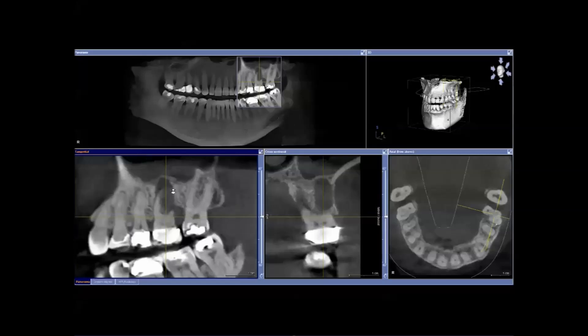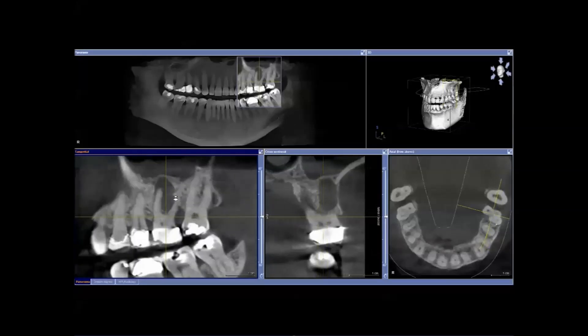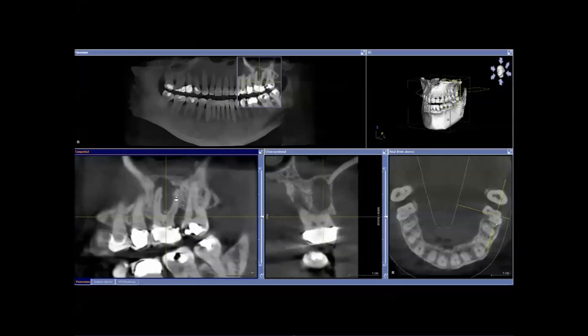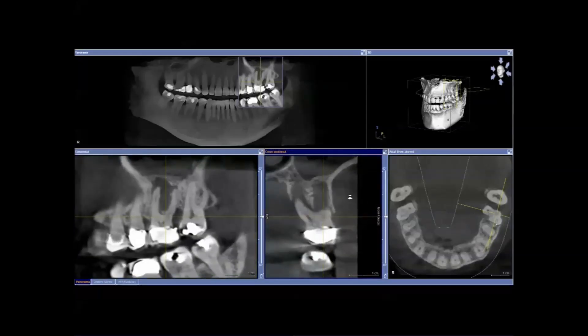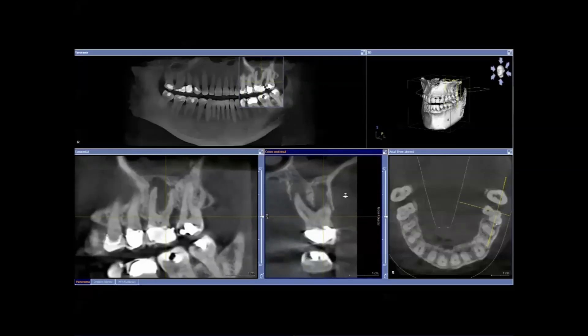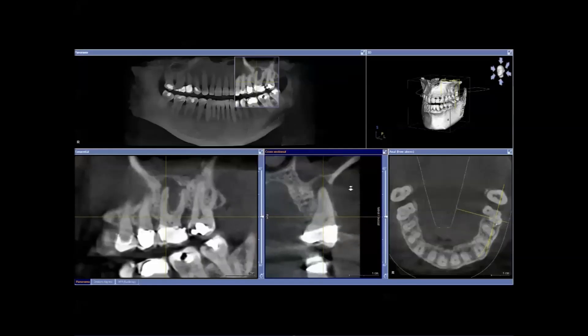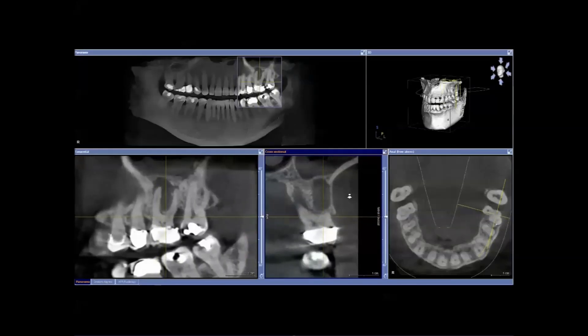This is how the patient initially presented — he had an upper left first molar with long-standing pain to biting, and the CBCT scan revealed extensive pathology around the tooth. All indications from probing and everything else were that the tooth was cracked, and so it was decided to remove the tooth and allow it to heal naturally without any grafting, due to the extensive infection.